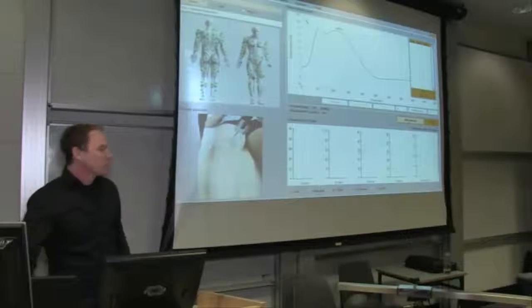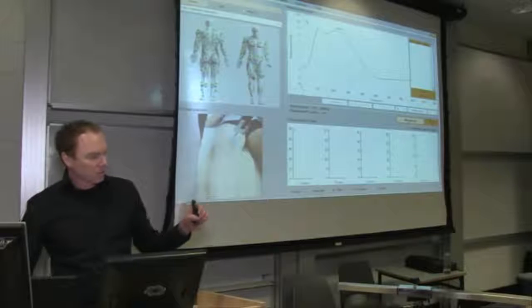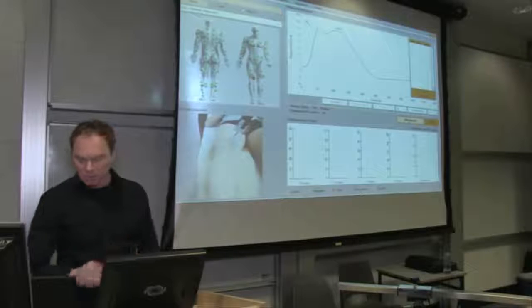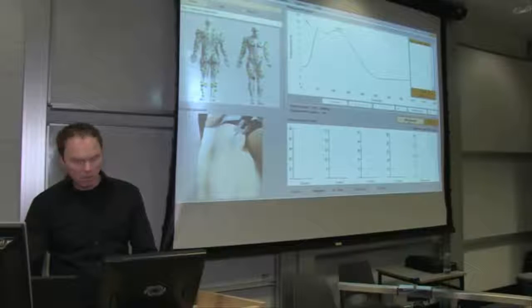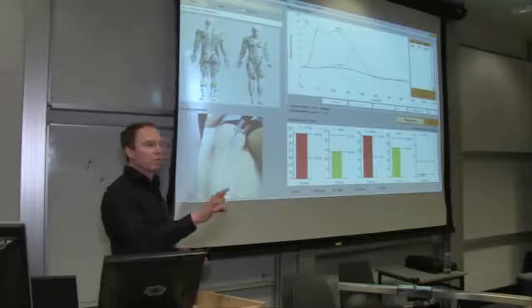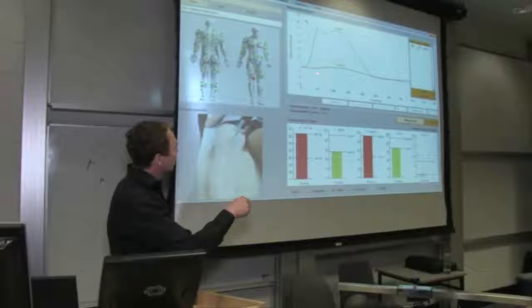Now I'll start with the measurement. So when I press measure, a small twitch should occur. Maybe it won't because the current is really low, but let us try. Something happened. I could see it from here. I don't know if you could see it from there. So that's the first response.